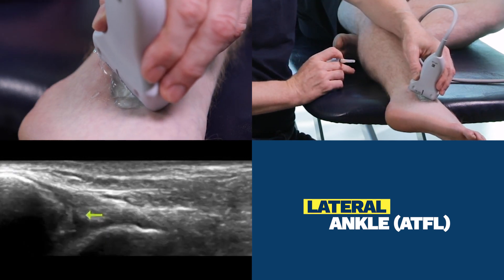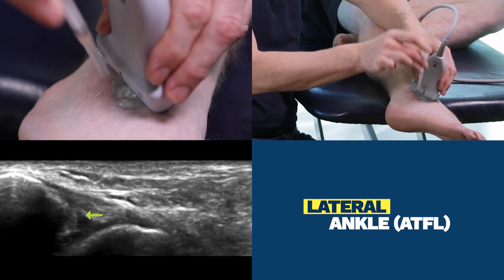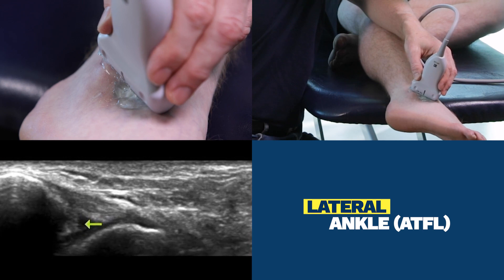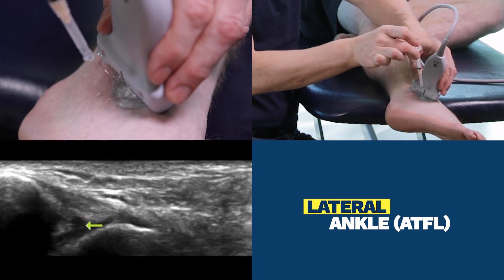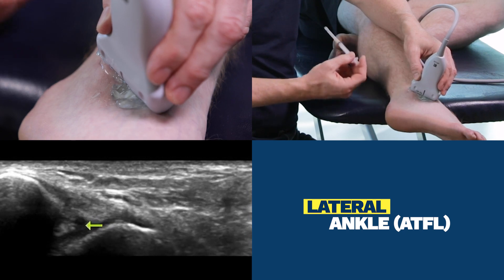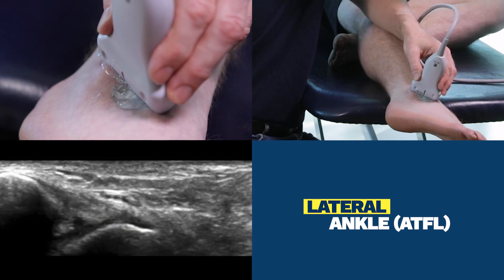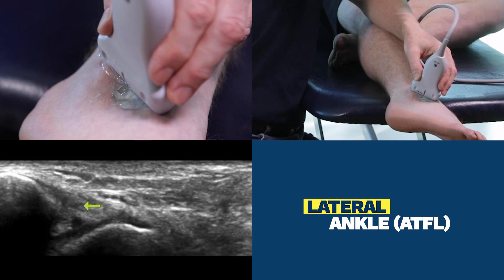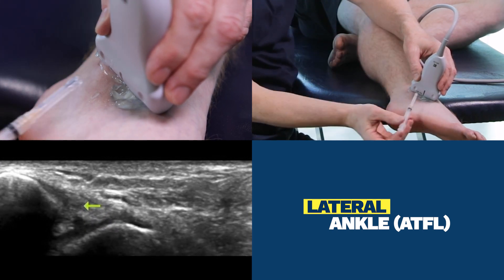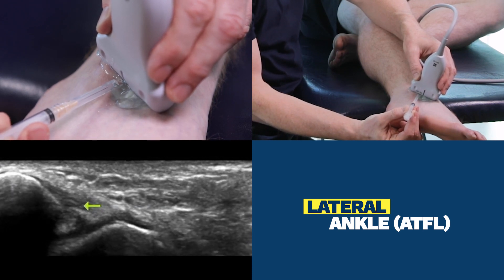If I were to inject the ankle joint, I'd be coming steep like this and I'd put my needle right where the tip of the yellow arrow is now. If I wanted to inject into the ATFL itself, I would bring my target to here and I'll usually enter at quite a flat angle like this.